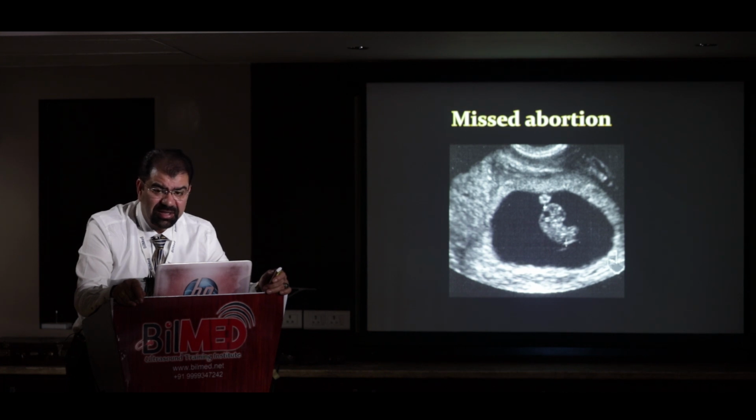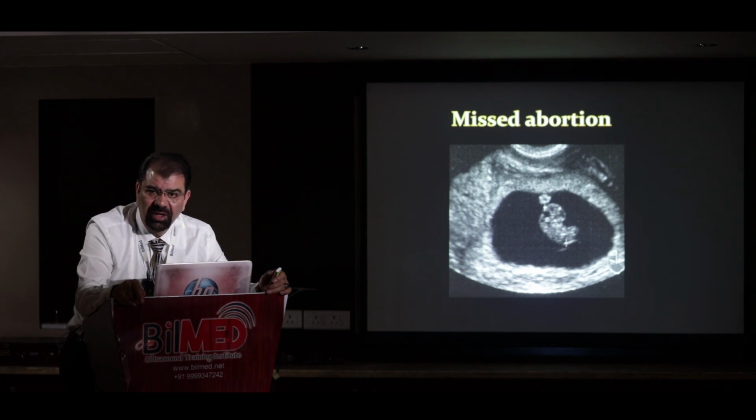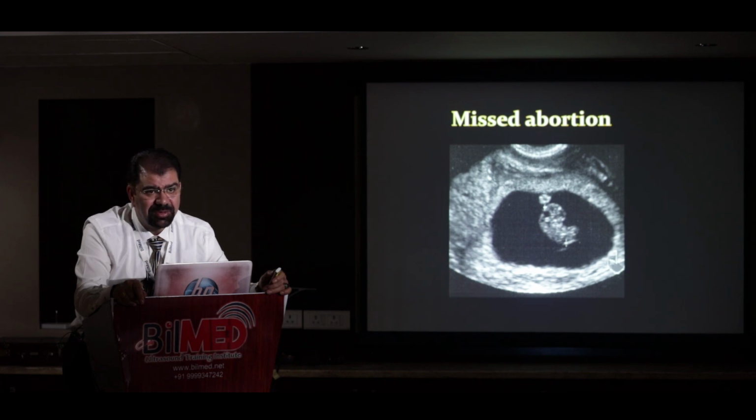And the point is, even if it is not dead today, for sure it will be dead tomorrow. So I will alert the patient and I will report this. If I am seeing a fetal heart, most probably I will be having a low fetal cardiac activity not corresponding with CRL. So if I report these things, maybe I will save a life. Maybe I am dealing with a very precious pregnancy.